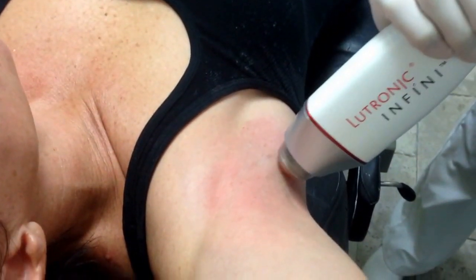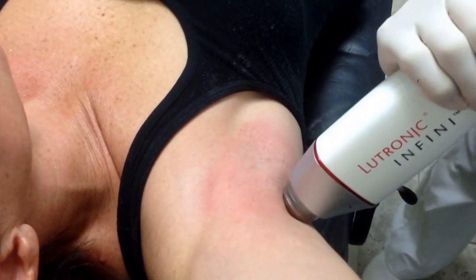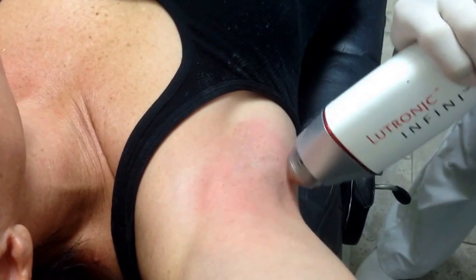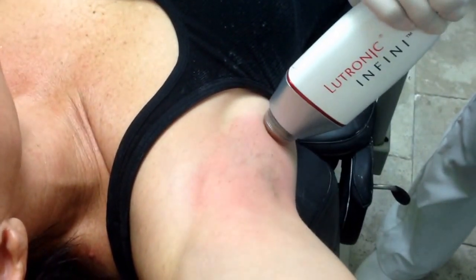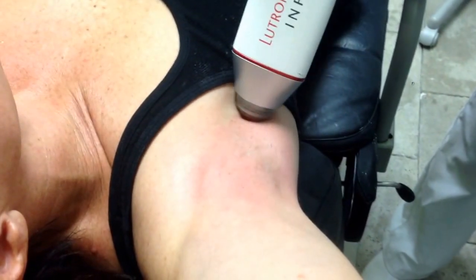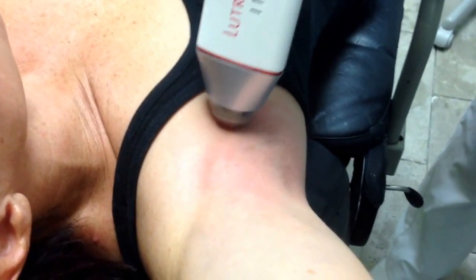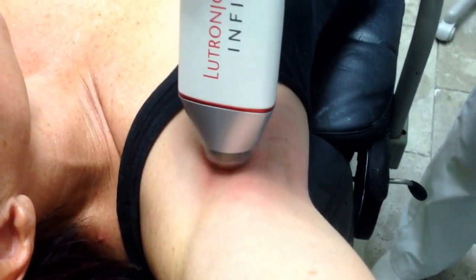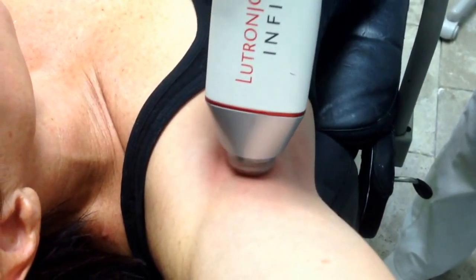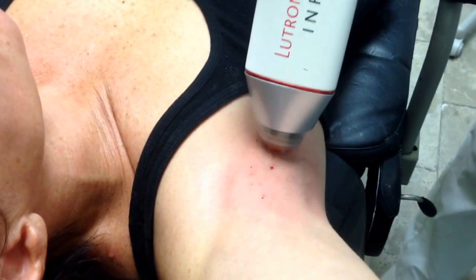It usually takes about three different treatments to do this, and we get probably 90-95% improvement after three. This is pretty historic because it hasn't been demonstrated before with the Infini, and we've done three patients now and shown that it should be a long-lasting correction because these glands don't grow back.